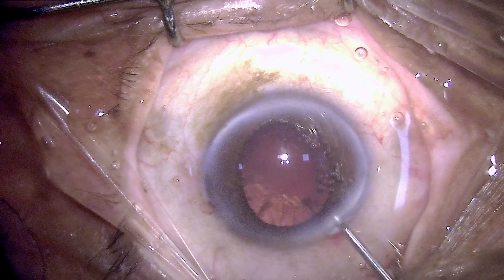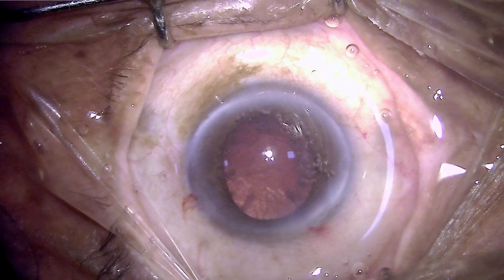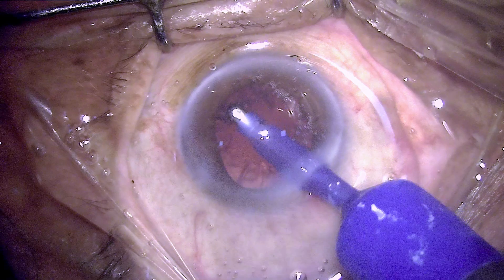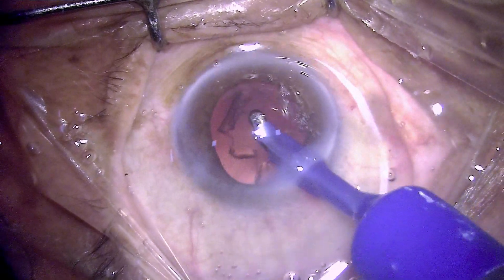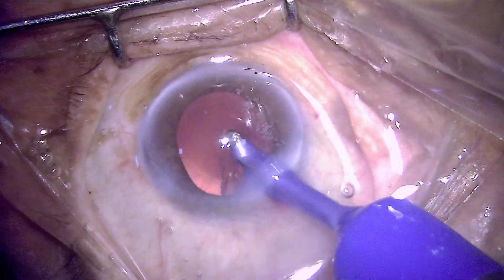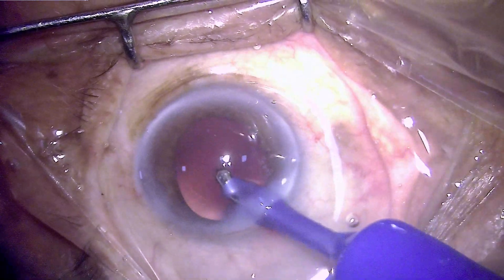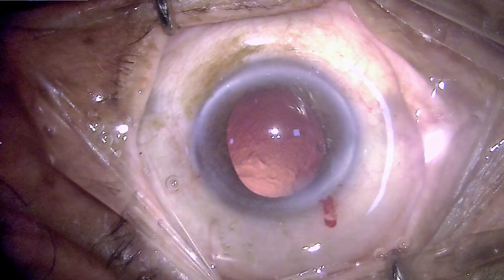Filling up the anterior chamber with a small amount of dispersive viscoelastic to coat the endothelium, then proceeding to remove the cortex. Although the cortex is very little in amount, it is significant, and this is a delicate job because you have to peel the cortex away from the capsule without damage. The best way is to engage the lens fibers at the capsule fornix border and then peel them away so you don't have to reach up to the posterior capsule. The subincisional area must be carefully handled to avoid touching the posterior capsule, as visibility is limited.